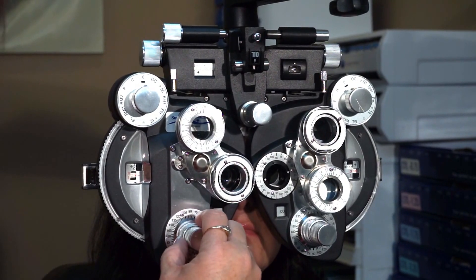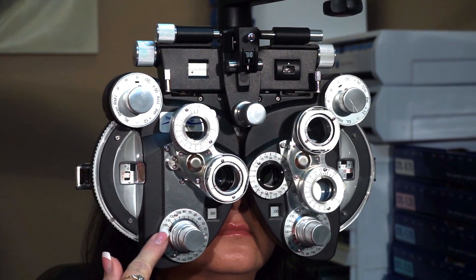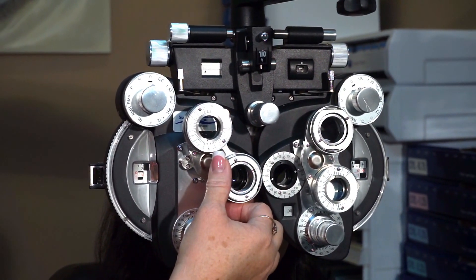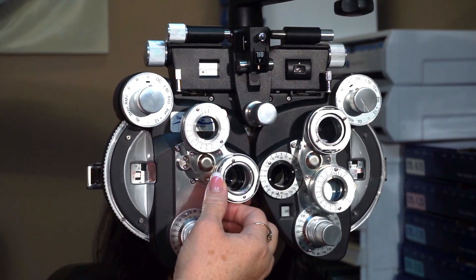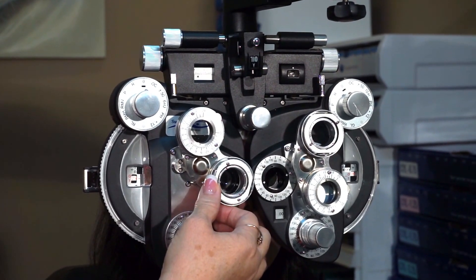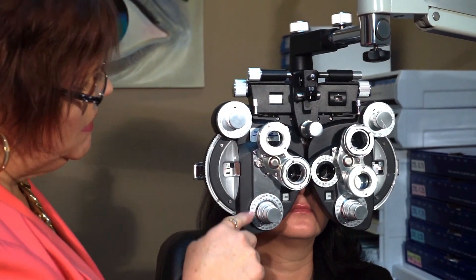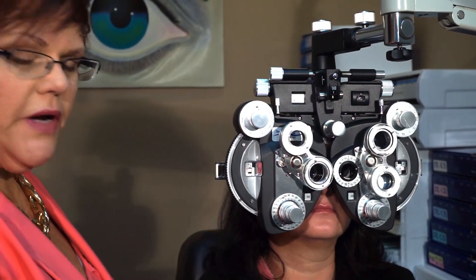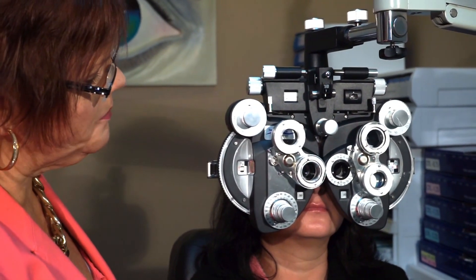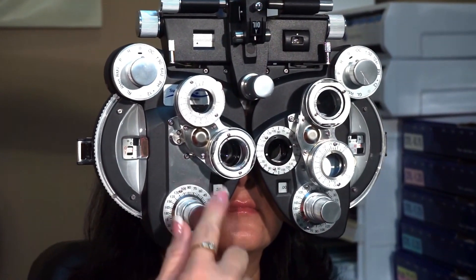So I'm now at axis 170. I'm going to turn it 10 more degrees towards the white dot — now I'm at axis 160. Which lens is sharpest and clearest, Lori — lens one or two or about the same? Two. So when I was at axis 160, she wants to go back the other direction. When I was at axis 170 she wanted to go this way, now at axis 160 she wants to go the other way. That tells me my axis is somewhere between axis 170 and axis 160.